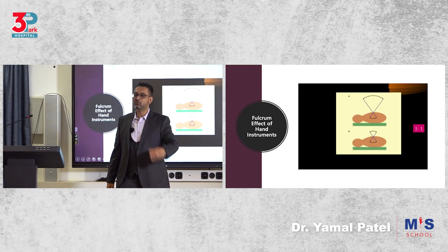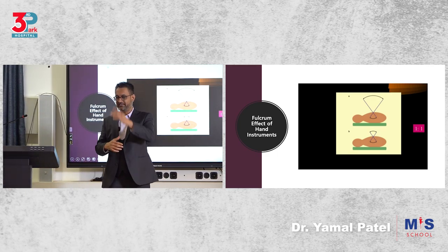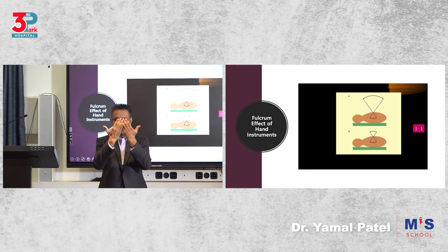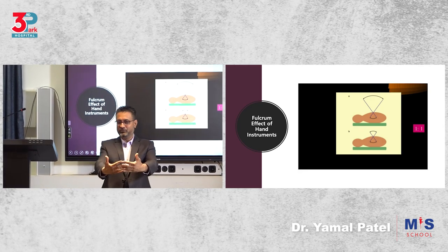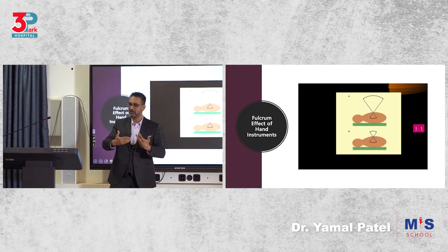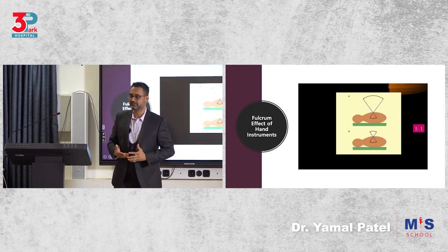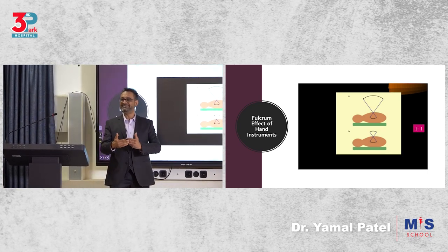You move your scope away, go higher, and then you'll see the pathology there. It automatically looks less threatening to you. All right? You'll be like, it's okay, that uterus I can handle. So don't work with the uterus this way. You've understood what I'm saying? Keep it far. So change your positioning based on that. There's no standard positioning. You have guidelines, but based on pathology, you might change.